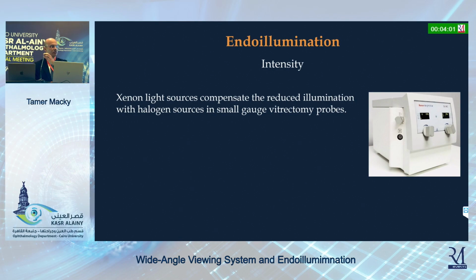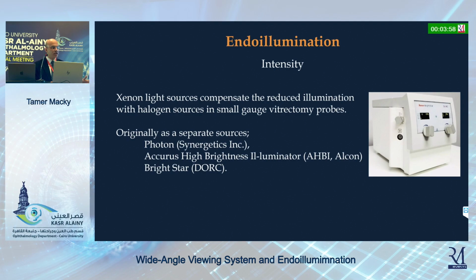And then the xenon light sources were introduced. Originally, they were introduced as separate sources, like the Photon, Accurus, and Bright Star, and now they are built into the machines.